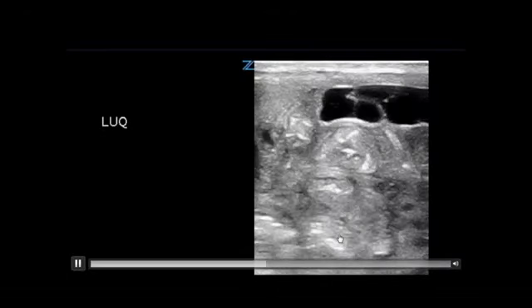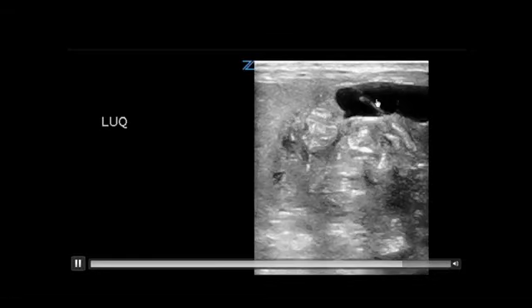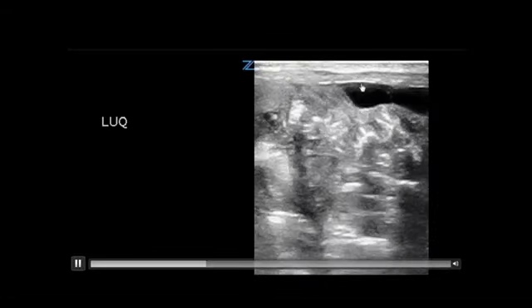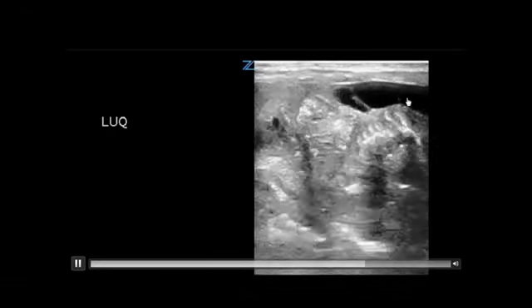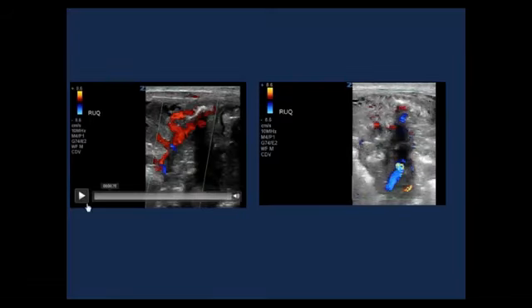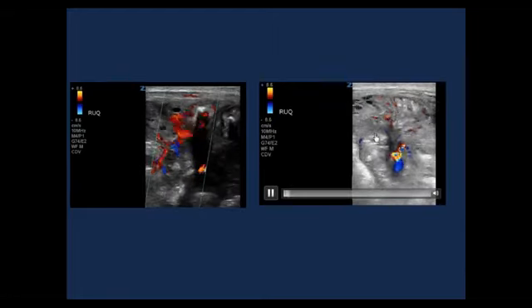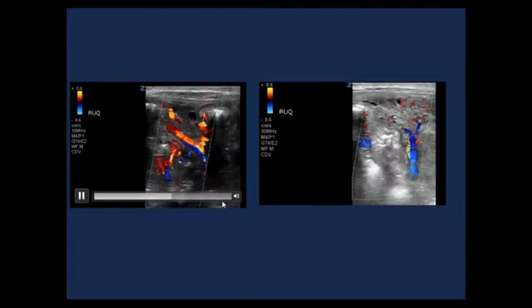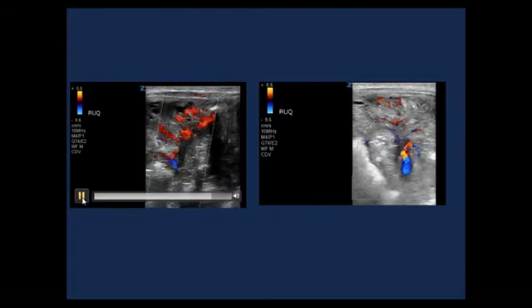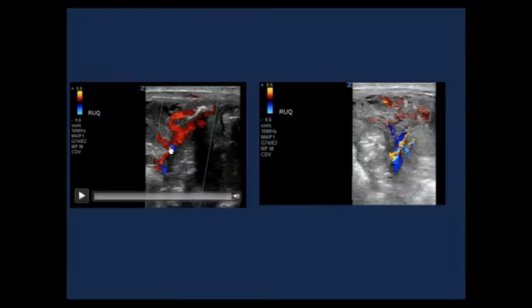But when we performed ultrasound, we found significant echogenicity of the bowel. There is no active peristalsis. With complex fluid, you can see the abdominal wall, and below it you have a black or hypoechoic area of fluid, septated, which is a sign of complex fluid. By color Doppler, significant hyperemia alternating with areas of ischemia, absent color Doppler. So you can recognize a Y-shaped pattern in the color Doppler.